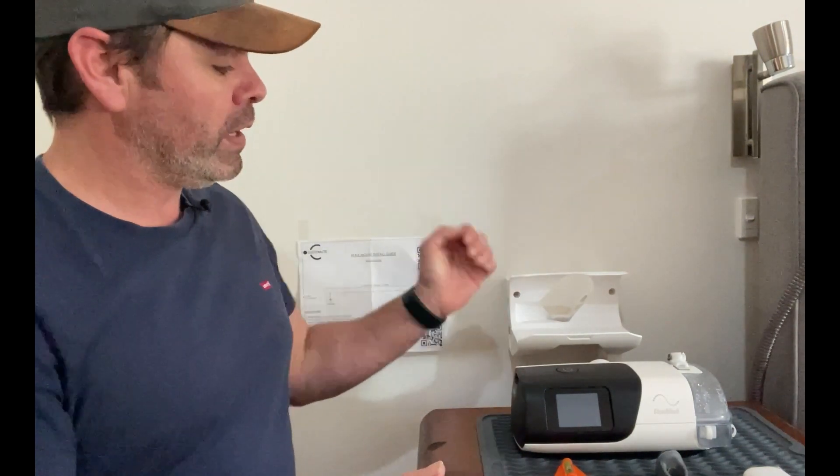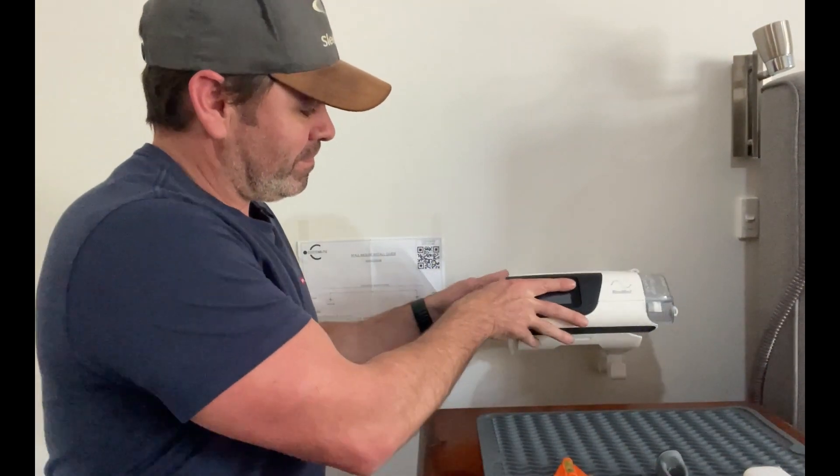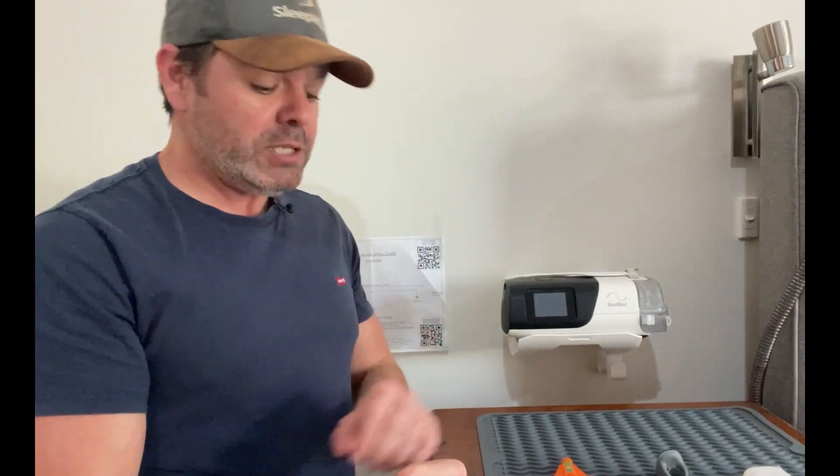G'day mates, welcome back to Uncle Nico's Home Handyman channel. Today I'll teach you how to install an AirSense 11 custom wall mount that I've picked up on Etsy. How cool is that? Now here's what you'll need.